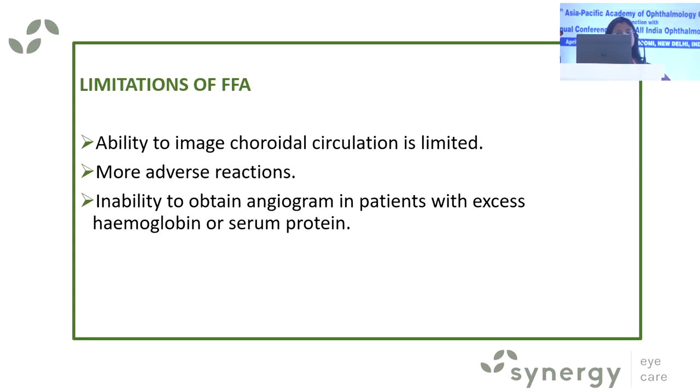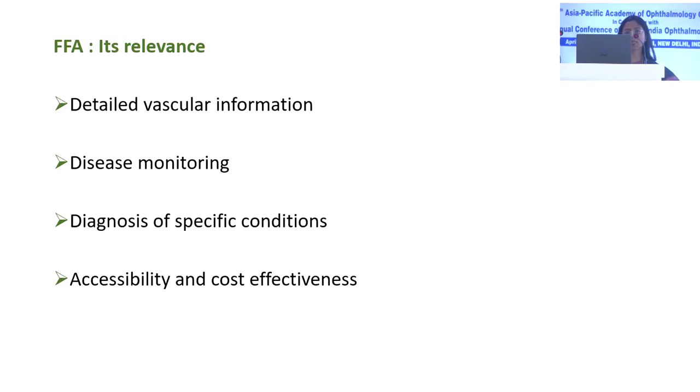Now let's come to the limitation of FFA. So FFA has limited ability to image the choroidal circulation, and of course it is associated with some serious adverse reactions, and it is not able to obtain angiograms in a patient where there is excess of hemoglobin or serum proteins. However, FFA is still relevant today as a key diagnostic tool because it gives a detailed picture of the vasculature of the retina and helps in diagnosing various retinal conditions.